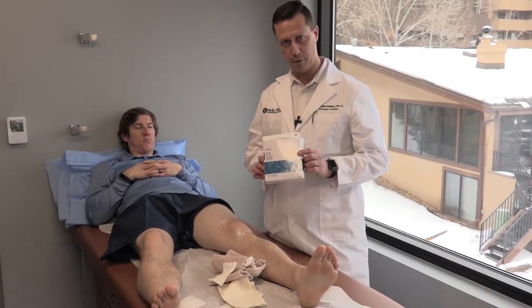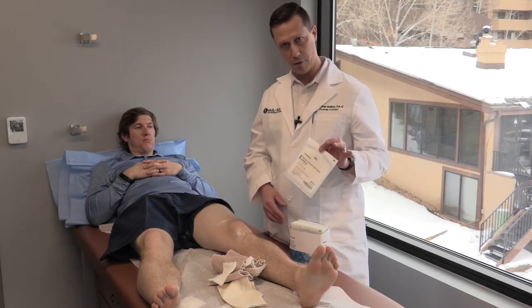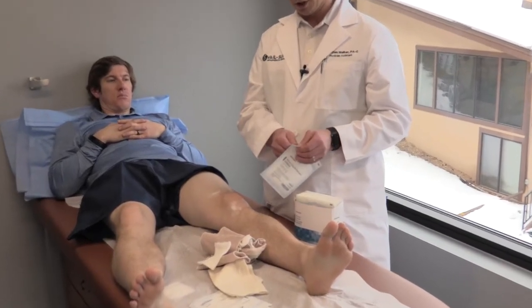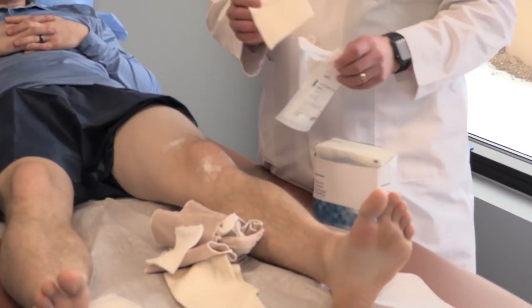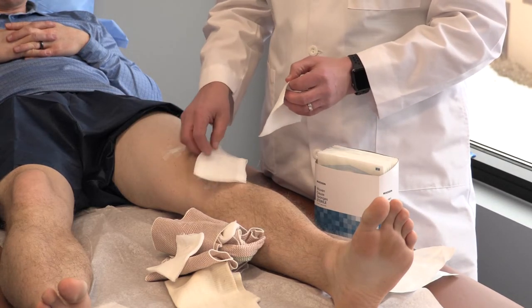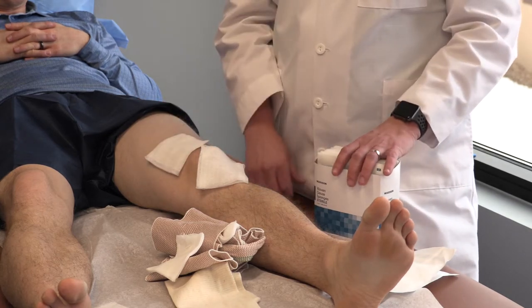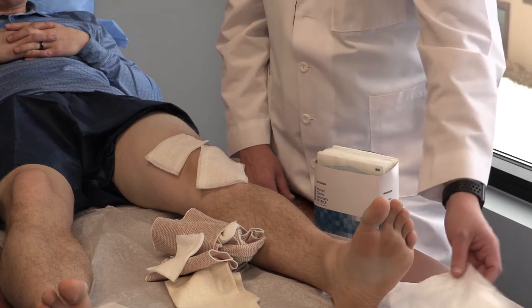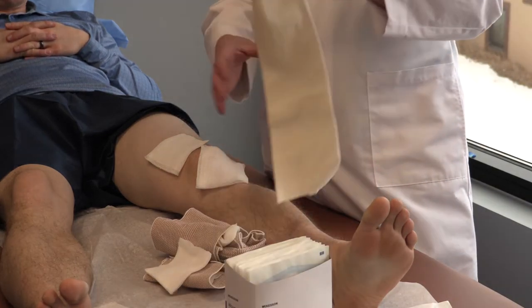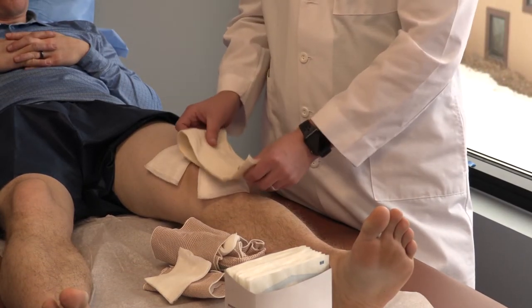We'll send you home with a whole box of 4x4s — these are just normal gauze that you can get at any pharmacy, so if you run out, you can go grab a few more. All you have to do is open up a couple, just enough to cover each incision. It's really just there to keep everything dry and keep it from leaking on your clothes if it does bleed a little bit at the beginning. Cover each incision and then we'll give you two of these little tube grips that will pull up and hold everything in place.